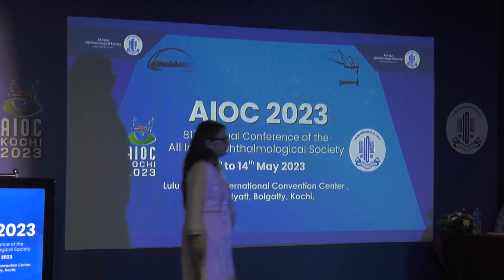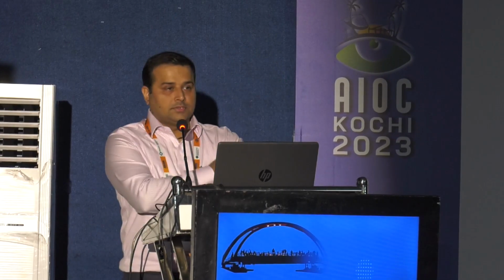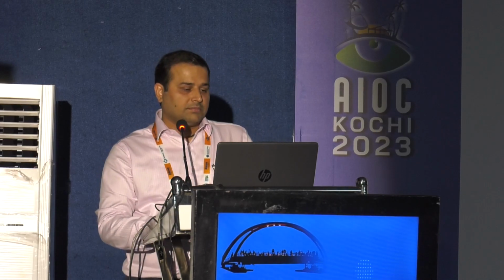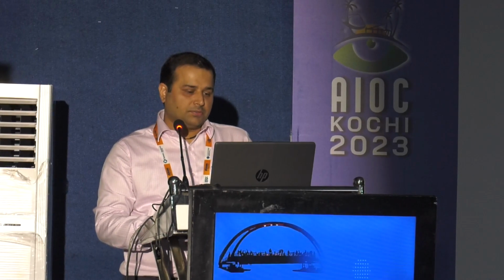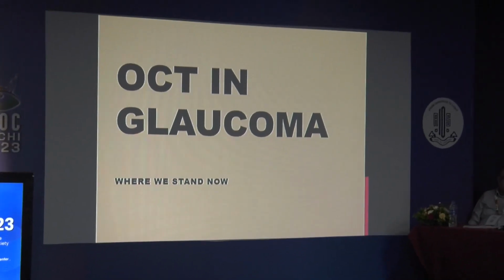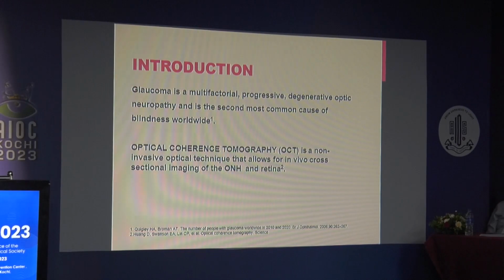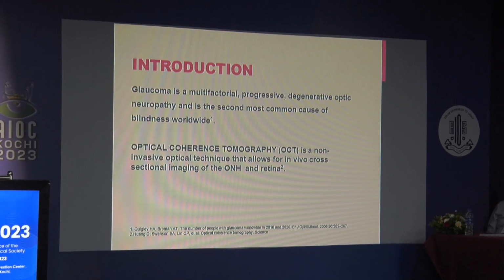So now we come to the last talk on the OCT and glaucoma. Ma'am has beautifully elaborated the role of OCT in neuro-ophthalmology, and she highlighted the importance of RNFL and GCL. I will go a little basic in this because those are the last points to consider. Before reaching those points, we have to see certain things in the OCT printout. I will go on to that.